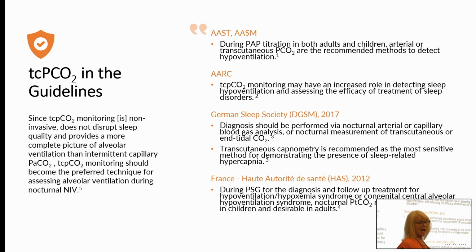One researcher highlighted transcutaneous technology, saying that since transcutaneous CO2 monitoring is non-invasive, it doesn't disrupt the sleep quality of the patient, and it provides a more complete picture of alveolar ventilation than intermittent CO2 information alone. Transcutaneous monitoring should become the preferred technique for assessing alveolar ventilation during nocturnal non-invasive ventilation.